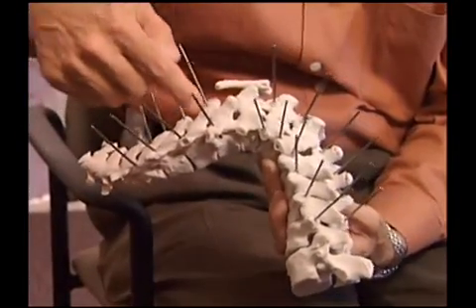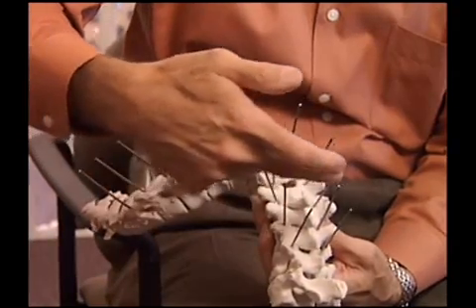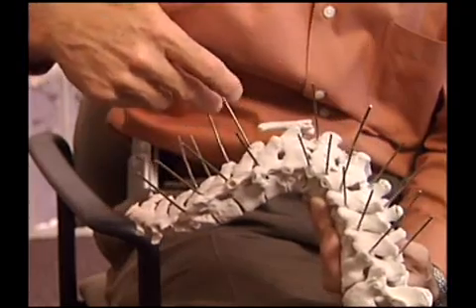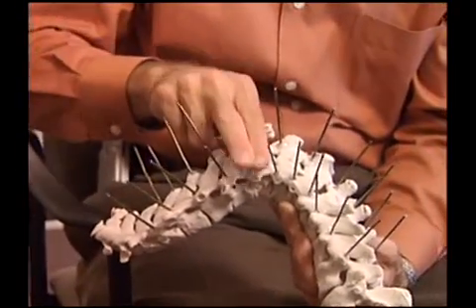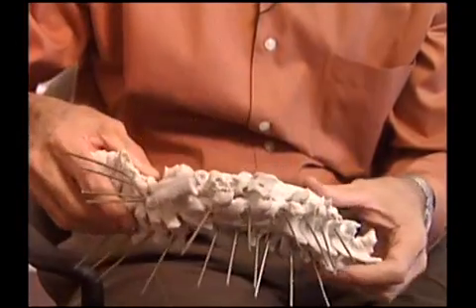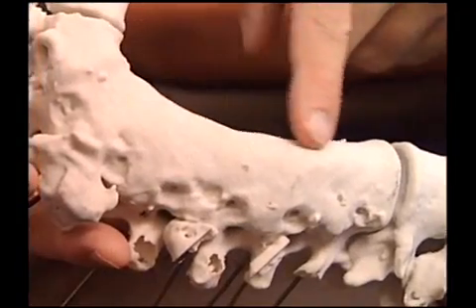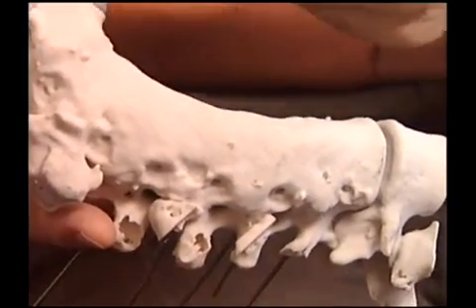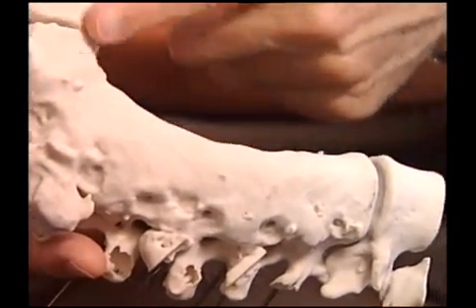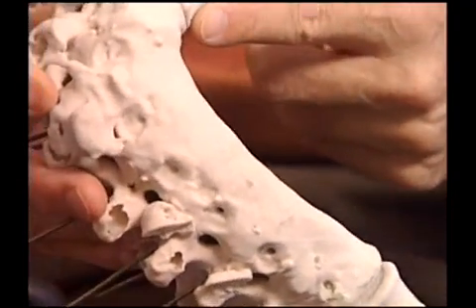Each one of these segments is numbered, and these are the directional markers for each one of the pedicles that we need to put a pedicle screw in. This is the segment that we're going to be resecting, and you can roll it around in space and see where the resection needs to take place. This is a previous anterior fusion here, and this was the resection that we were anticipating in this area here.